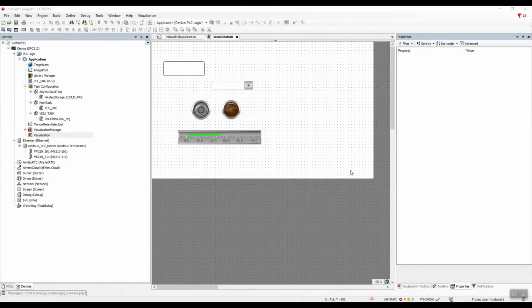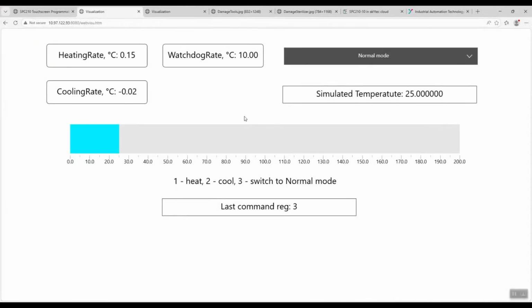according to the specified settings. We'll demonstrate how it works in action. To do this, let's set the heating rate. 0.15 degrees Celsius per second, which equals 9 degrees Celsius per minute. And the cooling rate is minus 0.02 degrees Celsius per second, which equals minus 1.2 degrees Celsius per minute.